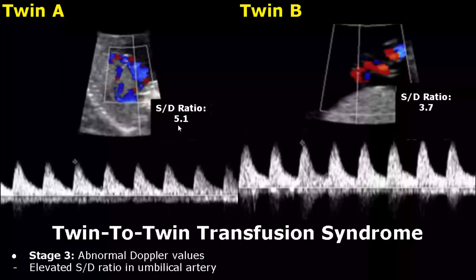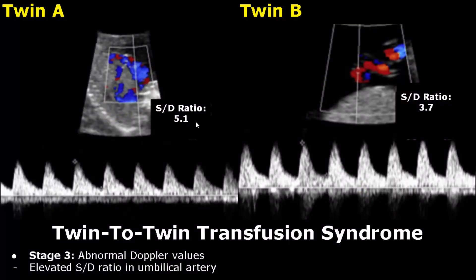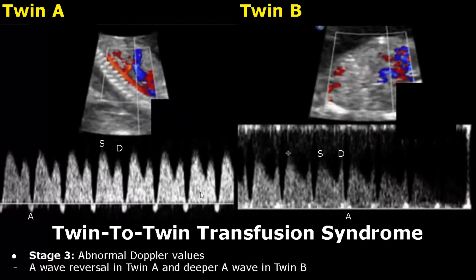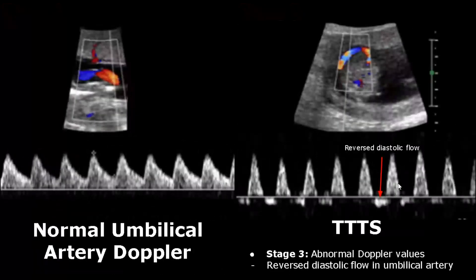In stage 3, abnormal Doppler values will be seen — the umbilical artery S/D ratio will be elevated. Abnormality in the A wave of the ductus venosus can occur as well. In these images there is A wave reversal in twin A and a deeper A wave in twin B. For the umbilical artery, reversed diastolic flow may be observed, with the diastolic flow seen below the baseline.